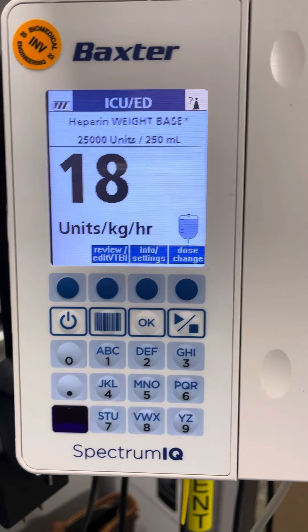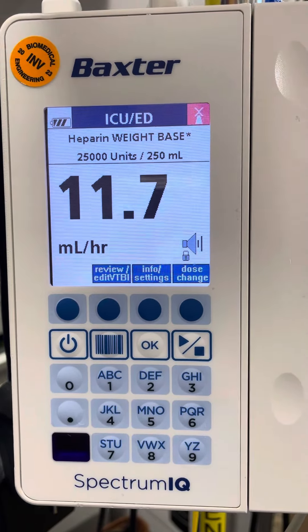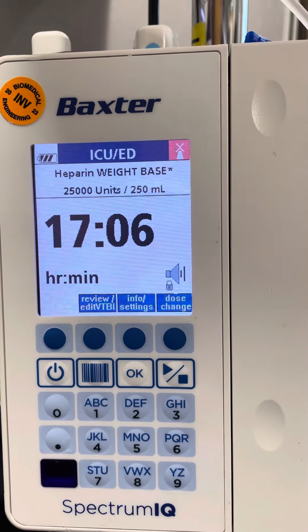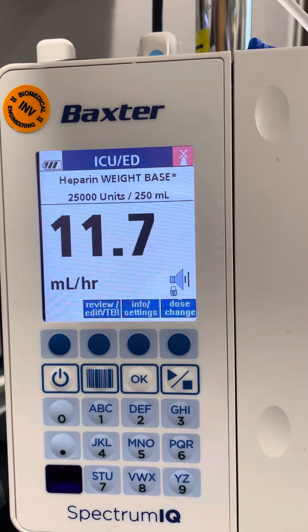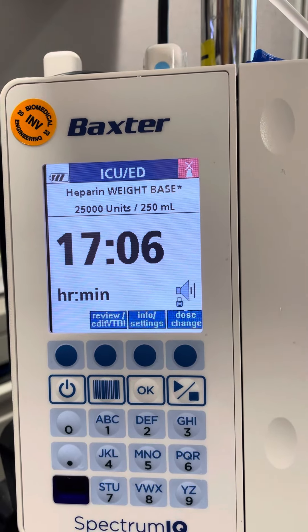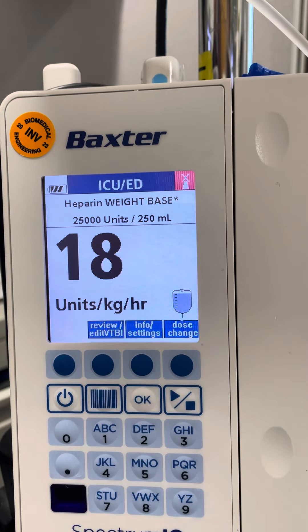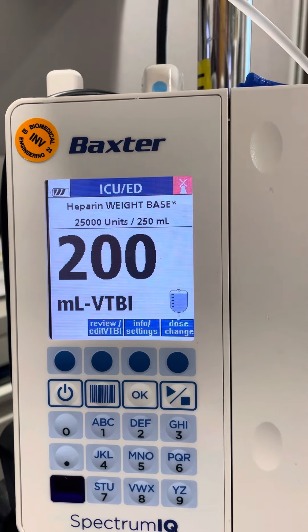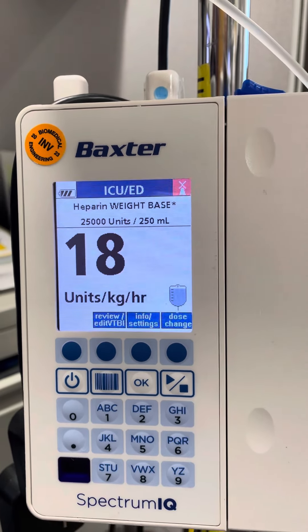This is a heparin infusion current state. Once programmed, the display screen scrolls through dose, milliliters, volume to be infused, and time left for the infusion. All the scrolling can be confusing, but there's a way that you can change what scrolls on the screen.